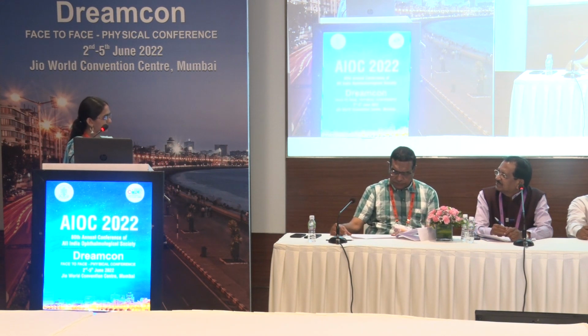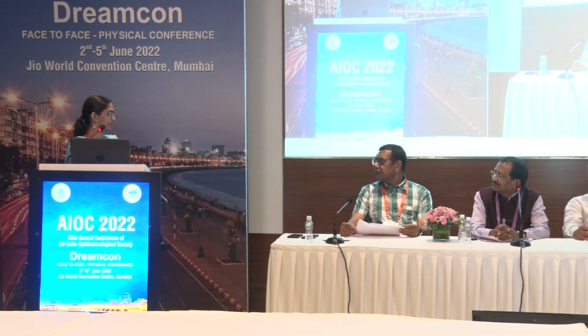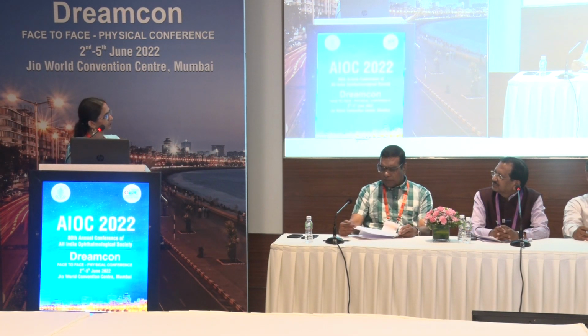The same capillaries can also be studied on a small portable dermoscope, which is also used by dermatologists for scleroderma diseases and all. That costs about 10,000 to 15,000. They use it regularly for their diseases, so they can also screen it for us and refer it to the ophthalmologist.